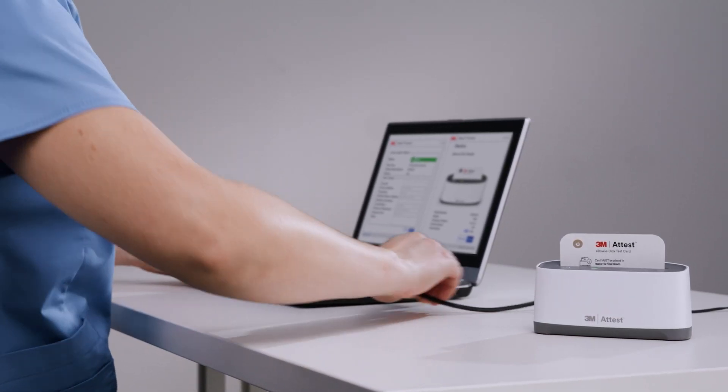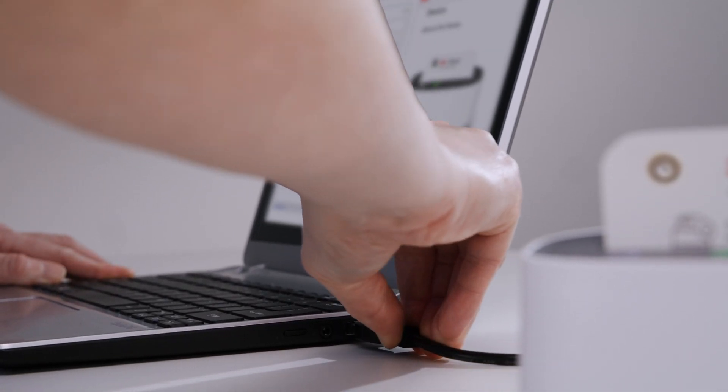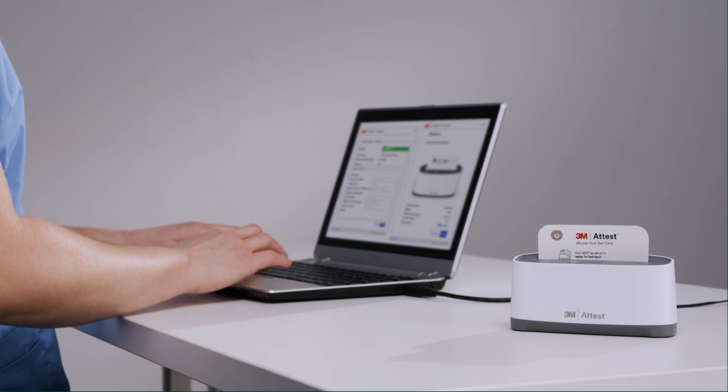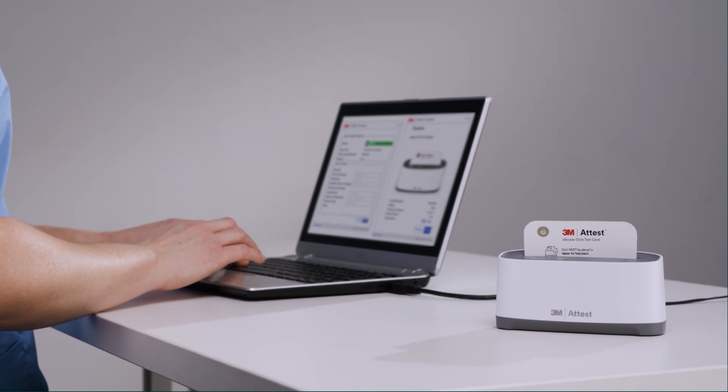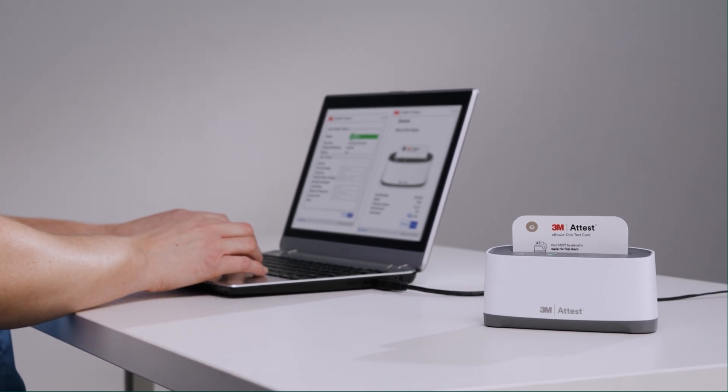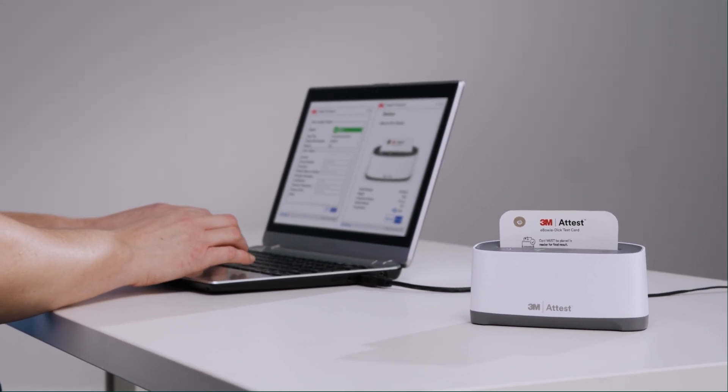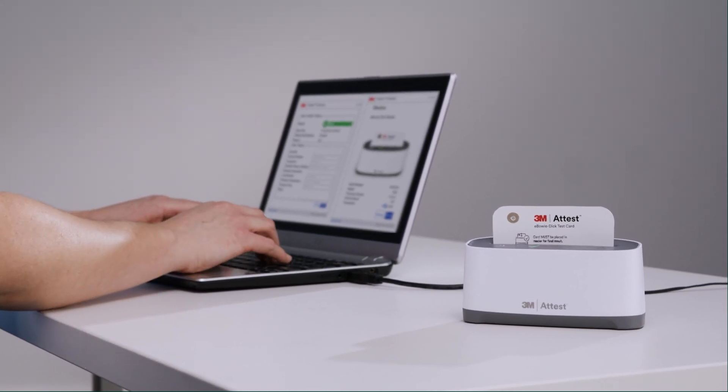Let's get you familiar with the home screen, which includes system settings, setting up your sterilizers, and your system's history.